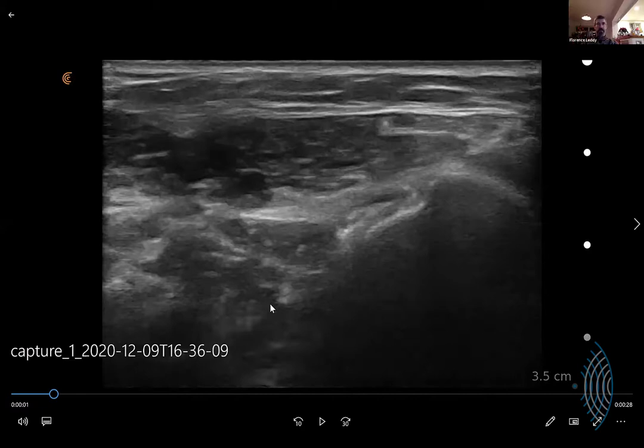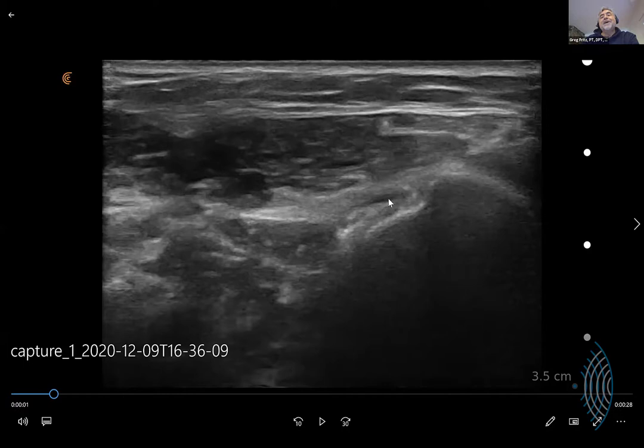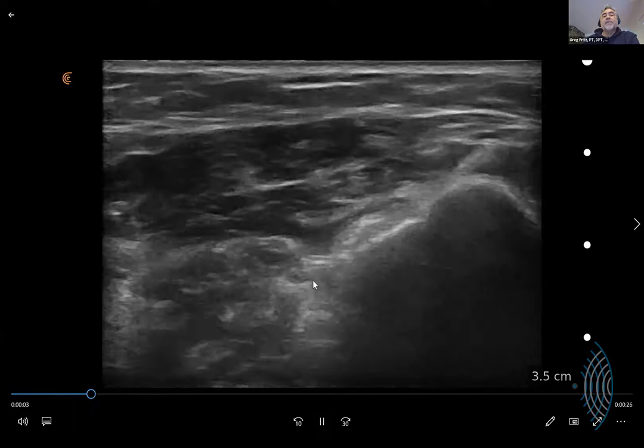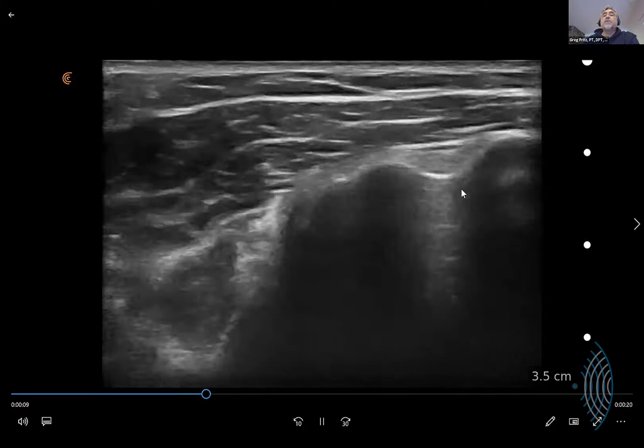I'm going to ask - can you see this now? I use Clarius so I know yours would be much clearer. You're oblique on that pec major tendon anyway, and the long head of the biceps would be here, and here's our humerus coming up there. I'm basically coming up doing a scan, coming through a short head underneath, and we're starting to see the bicipital groove here. The lesser tuberosity or tubercle is here.